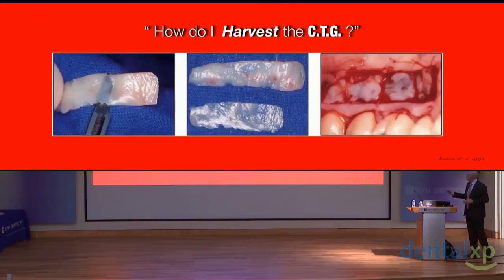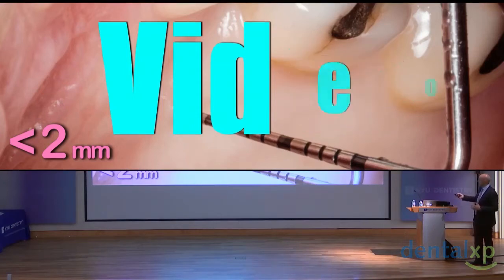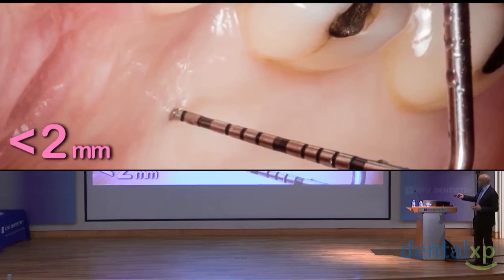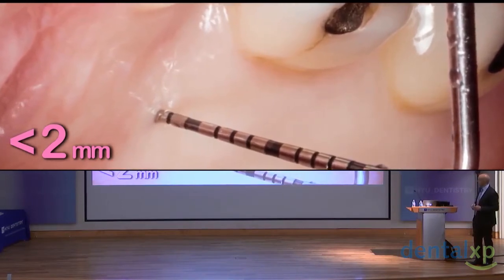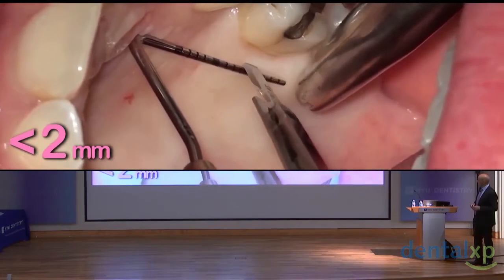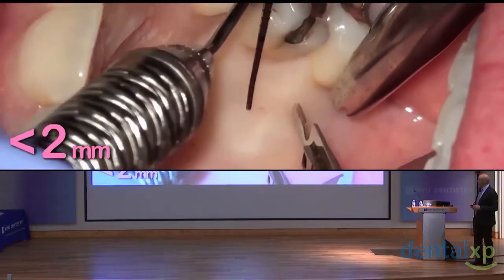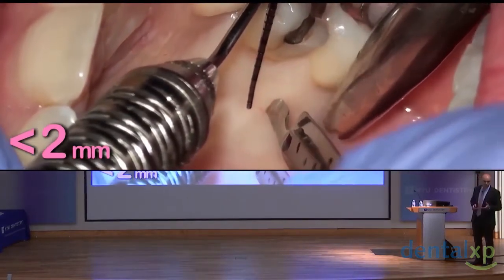So do I need to graft in every case? I don't think so. I only use this technique when I have less than 2 millimeters. Look at the picture, less than 2 millimeters of thickness in the palate. It's very easy to harvest the graft in that way, but I think it's not always necessary.